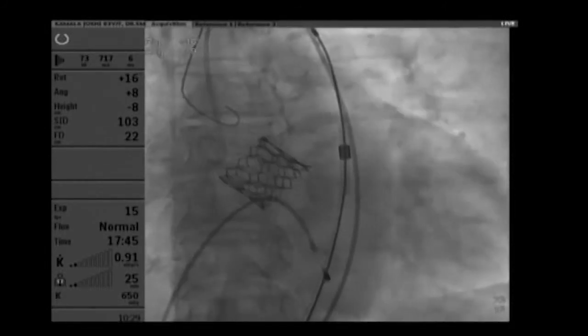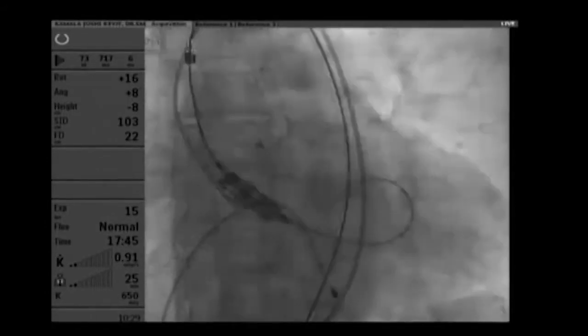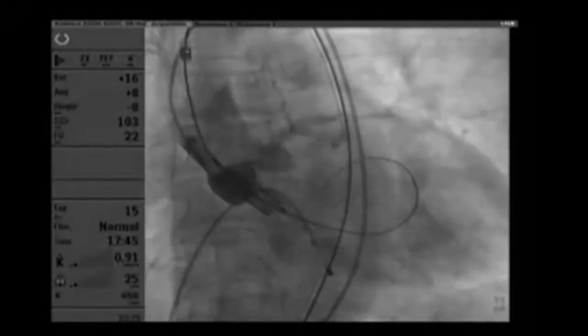Please, don't talk right now. I can't do anything about it. Cine minus. Cine minus. I'll handle it. Okay, next.